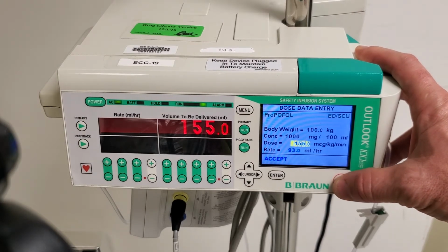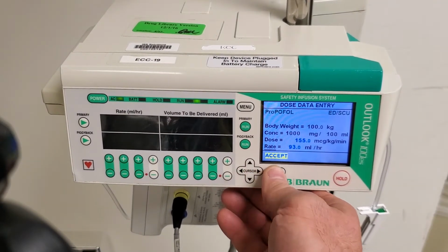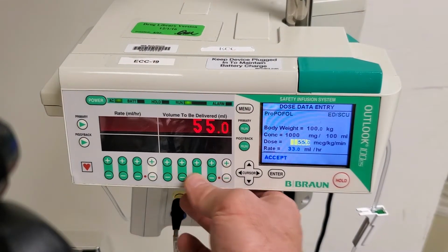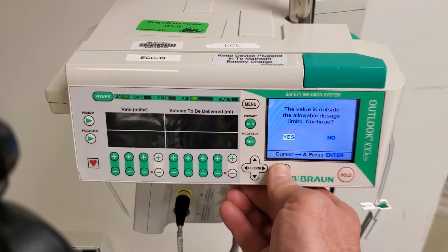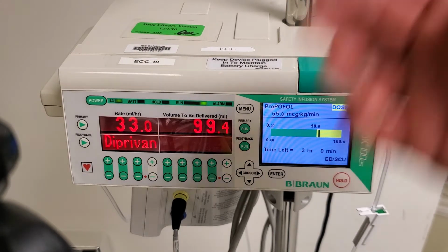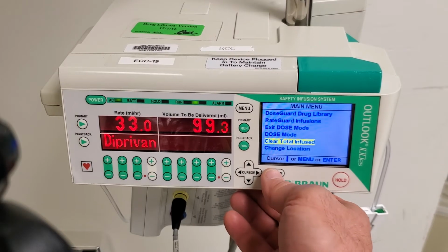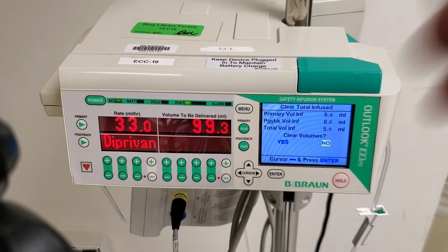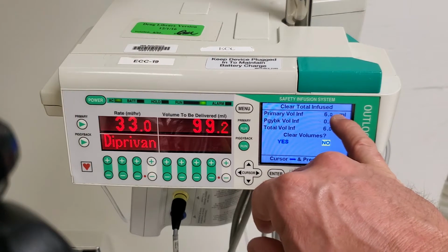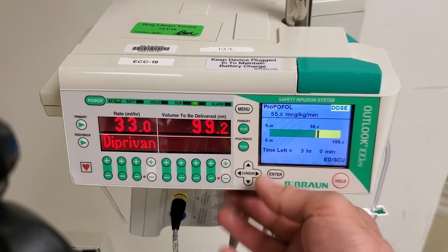Some important things to consider when you're using the pump, some handy features, are the fact that it keeps track of your volumes infused. So when you pick a patient up, you can use the menu key, go to clear total infused, and you can see how much has been infused at the sending facility. If they had delivered a piggyback volume, like an antibiotic, it would be listed here. We've delivered 6 mLs of primary volume, no secondary, for a total of 6. Then we can clear that volume counter.